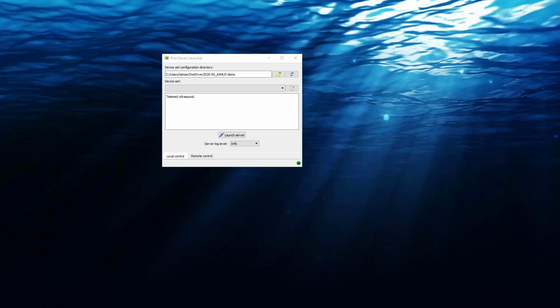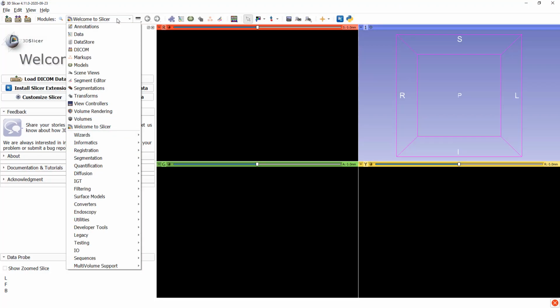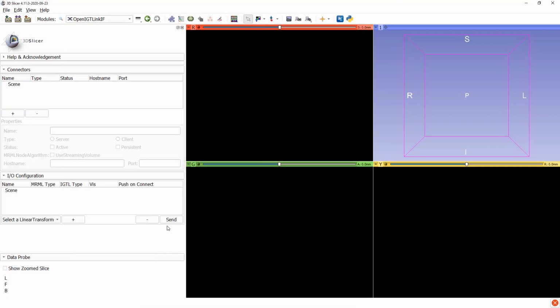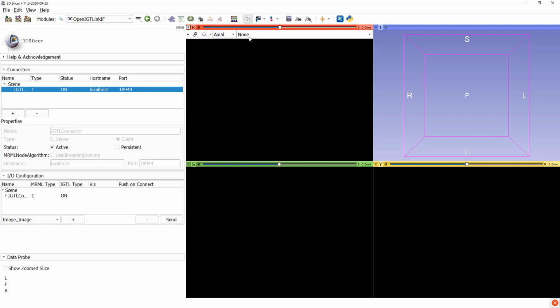So once we have these in Slicer, we can start Plus, which is communicating with the hardware in real time. In my case, I have a Telemed ultrasound and an optical tracker plugged into my computer. When I start, Plus connects to these hardware devices using a Plus config file that specifies the hardware. The documentation on how to write Plus config files is available on the Plus website.